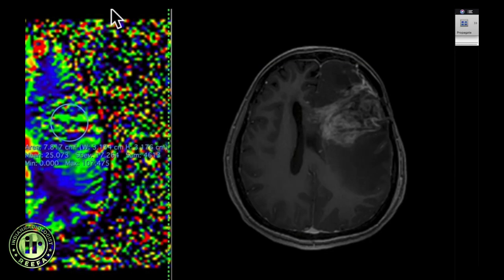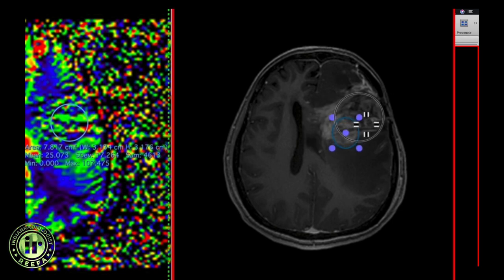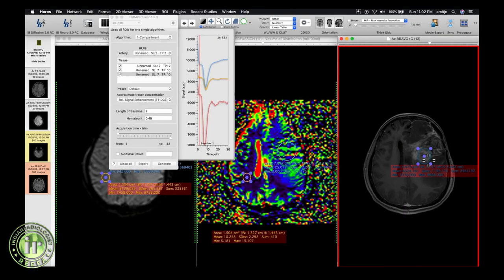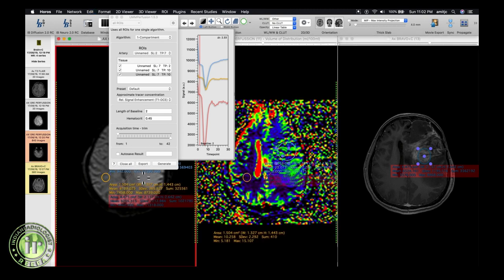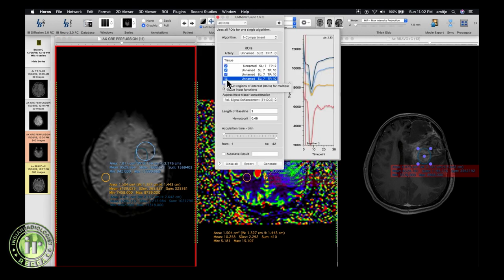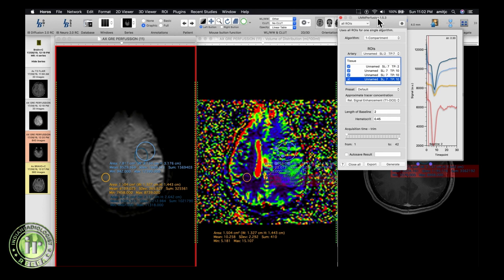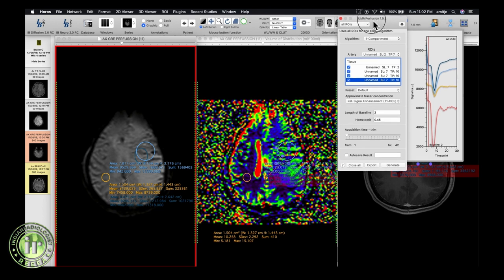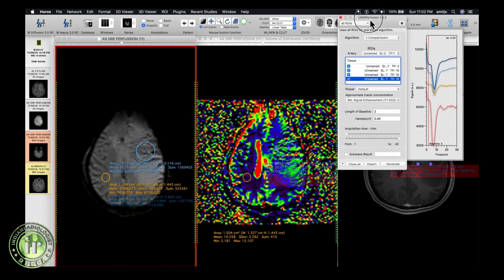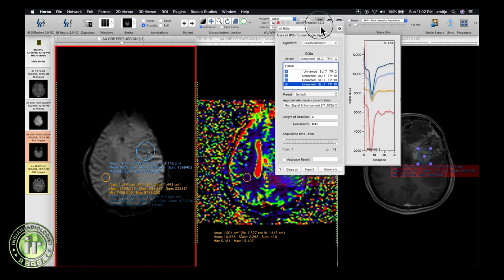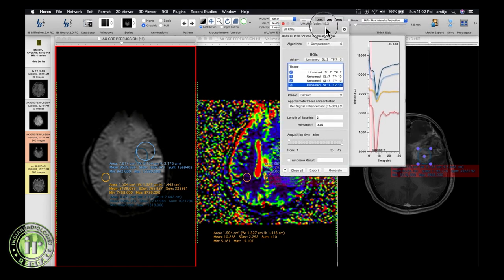ROIs can also be drawn on the enhancing portion of the tumor in the T1 post-contrast sequence, and this ROI can be copied onto the corresponding CBV and native perfusion images. Selecting this ROI will give the signal intensity-time curve for that ROI, seen here in dark blue. This is how one can perform perfusion analysis using the open source software UMM Perfusion, which is freely available — the link will be shared in the comments below.